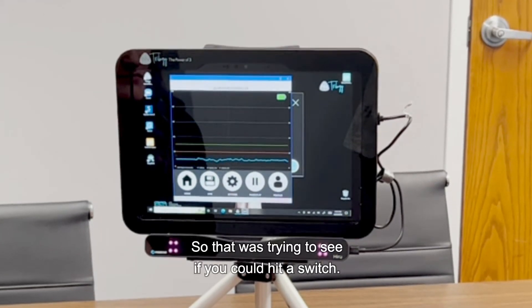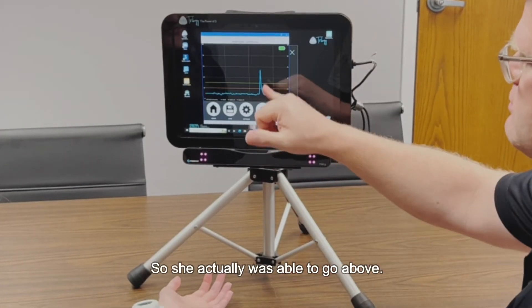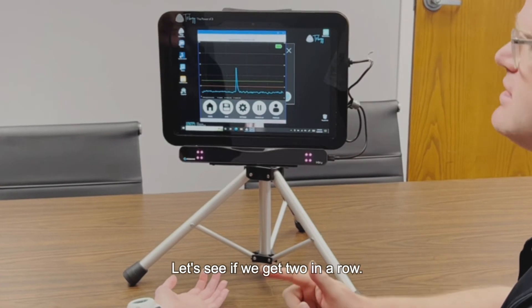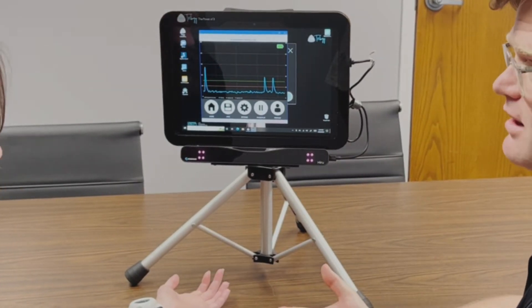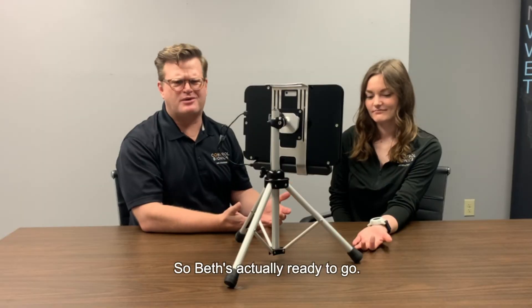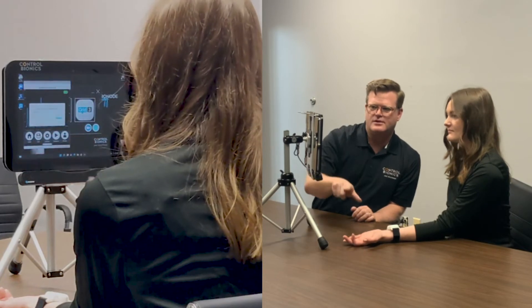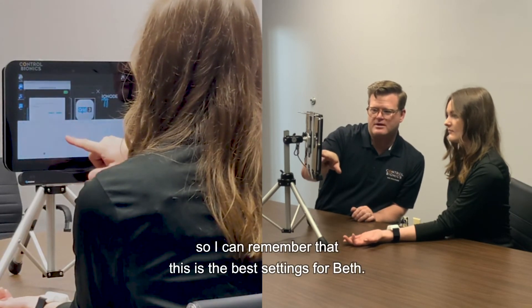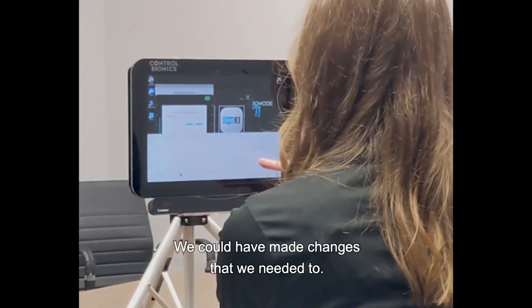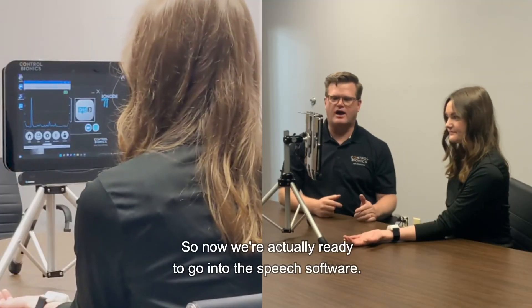When it cuts back, you'll see the line is dramatically lower. So Beth, let's try again to see if you can hit a switch. Awesome — she was actually able to go above the line. We heard the audible tone. Let's see if we can get two in a row. You're a rock star. Perfect. So Beth's actually ready to go. I can create a profile for her by hitting save and typing her name so I can remember that these are the best settings for Beth.